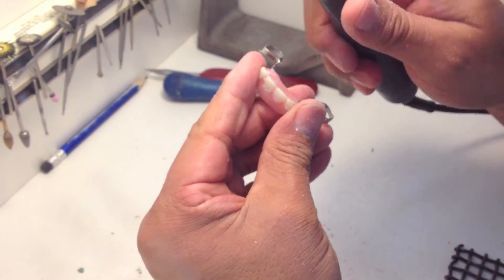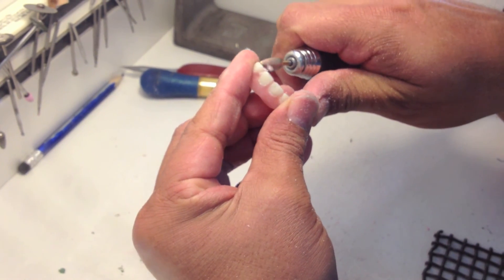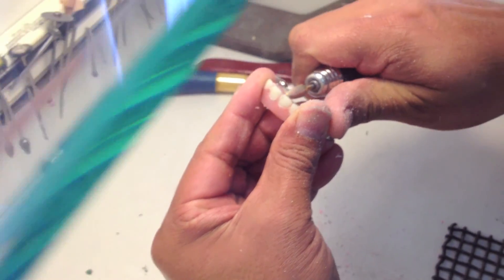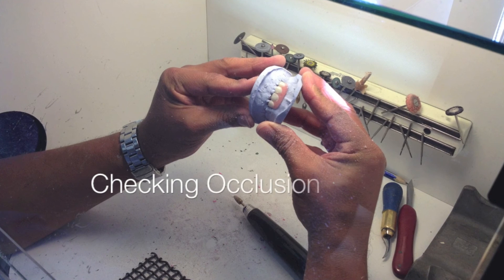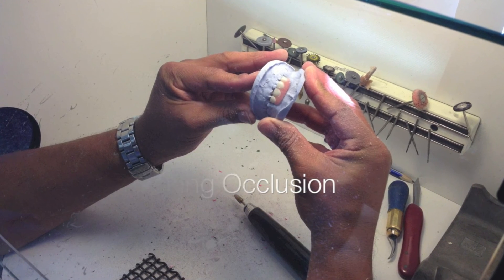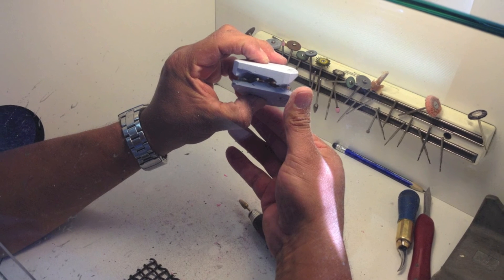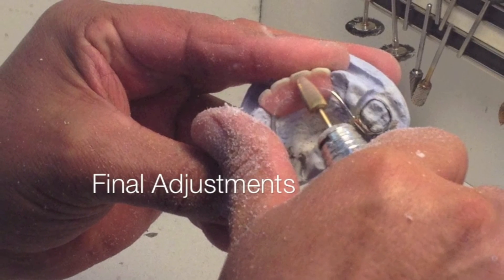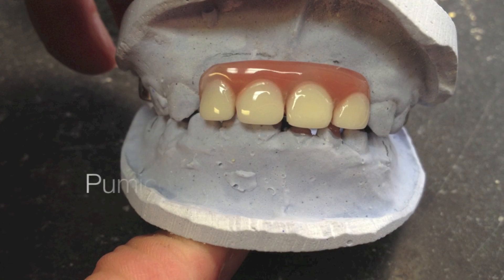He uses this acrylic burr because it's got a nice rounded end to be able to smooth out on the lingual side of these teeth. Here he is checking the occlusion to make sure it doesn't open the bite too much, and checking from the back side to make sure all the teeth touch. Then he adds a few finishing adjustments, and then we pumice and polish — and there's the finished product.